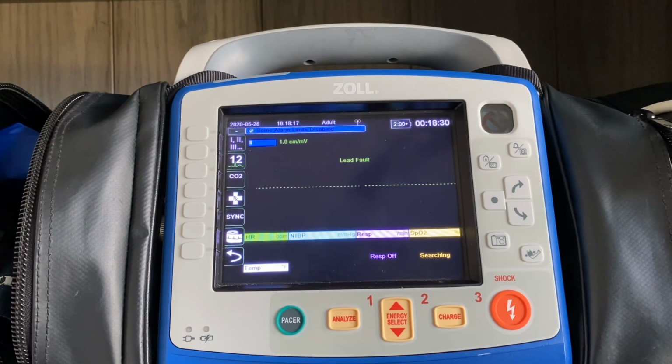Your goal, just like it would be for a cardiac arrest call, would be nice, flat, plateaued waveforms on the screen, showing a proper respiratory cycle. If I see that shark fin-shaped waveform, I can say to myself, hey, that's an asthmatic patient. I know what to do to treat an asthmatic patient, and then see how they react to that treatment accordingly.